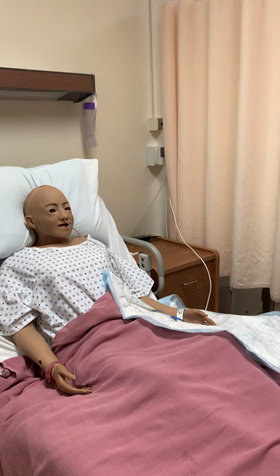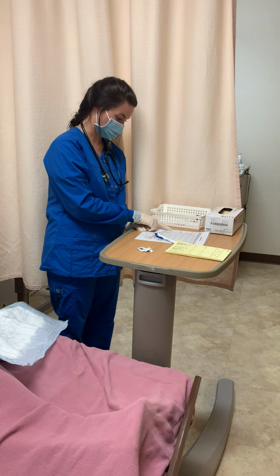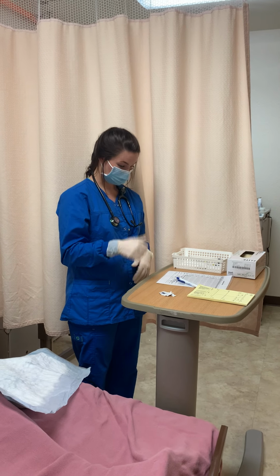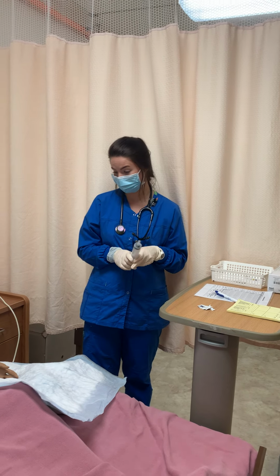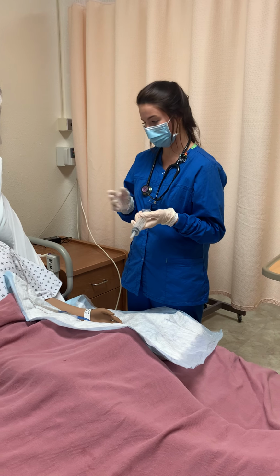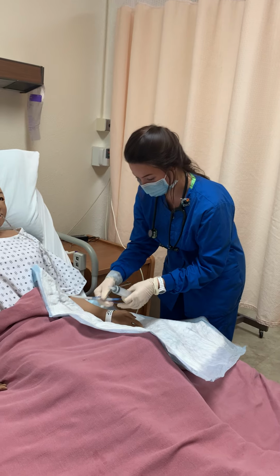Okay. I'm going to check here again on my order, do my second check. So yes, she needs Jevity, 1.5 calories, at 40 mils an hour with her continuous feeding. So first, before you do that, we just want to check for stomach residual. Make sure she doesn't have more than 250. If she were to have more than 250, we would wait an hour, check again. If it was still more than that, then we'd want to notify the provider.